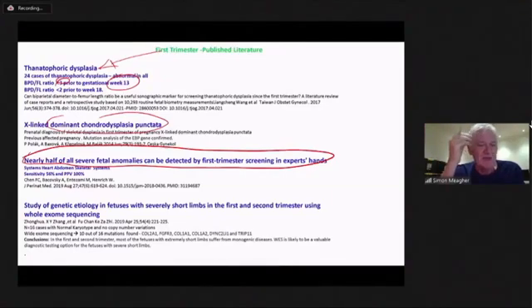And in a sense, when you see a fetus with an increased nuchal translucency, it comes back with normal chromosomes, that does not have a cardiac abnormality, the next organ system I think of is the skeleton. It comes next straight after cardiac. So it goes aneuploidy, cardiac, skeletal in a situation where you've got an increased nuchal translucency. Therefore, it becomes important in that group of patients to measure the femur length, to measure the humerus length.